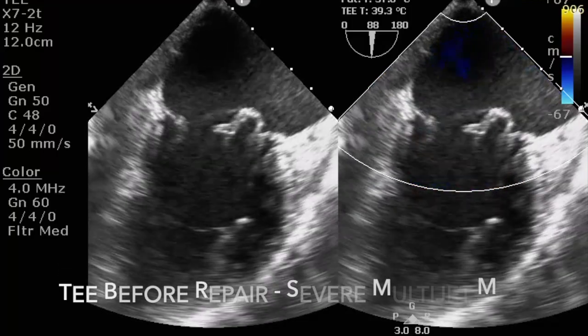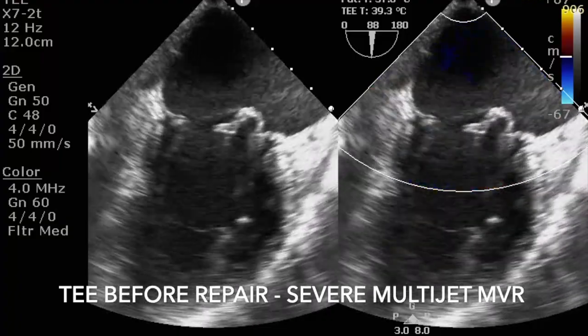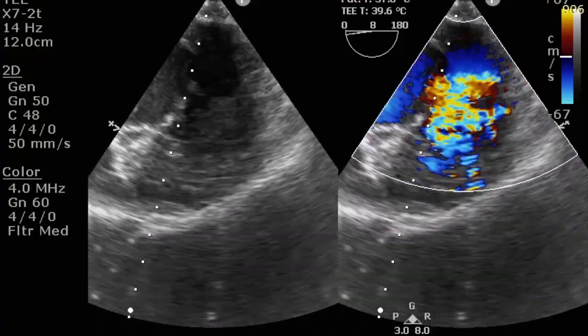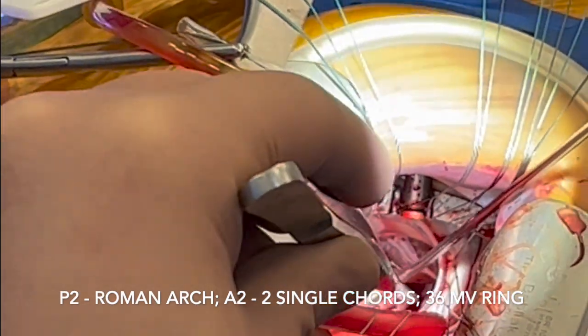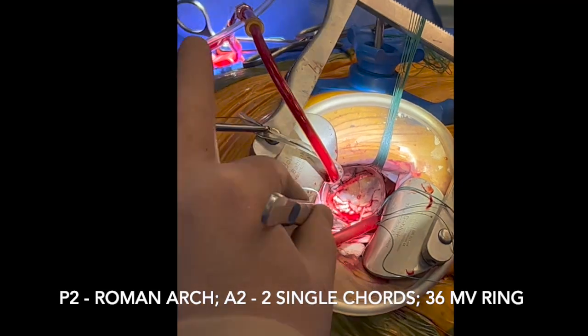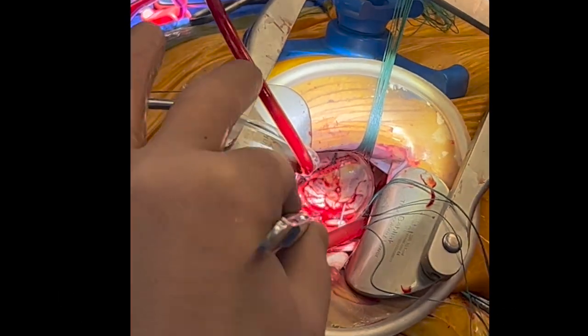I operated on an 82-year-old man with bileaflet prolapse and severe multi-jet mitral valve insufficiency. I performed Roman Arch repair for P2 and used two single, usual single cords for A2.